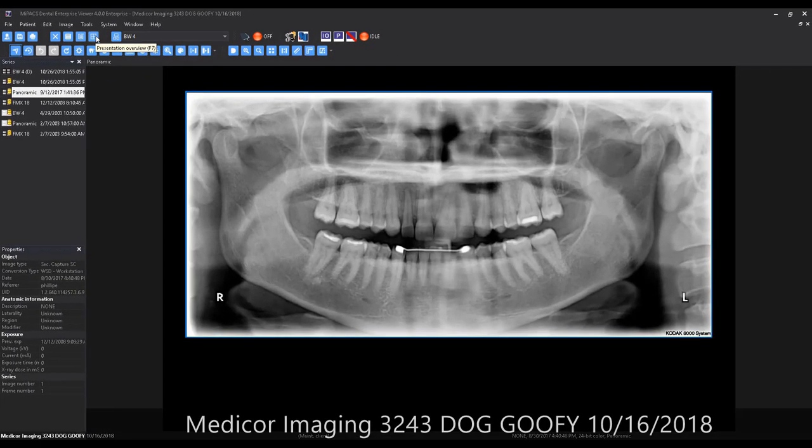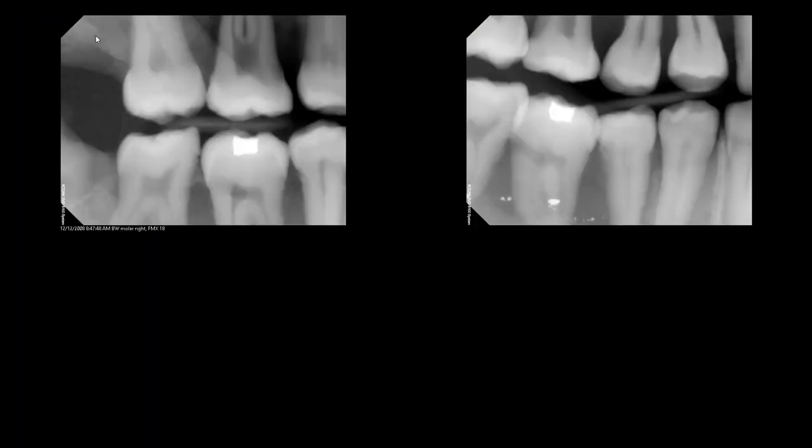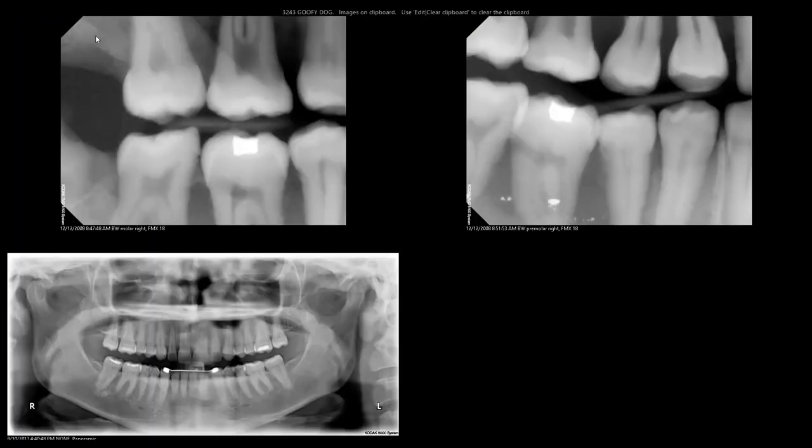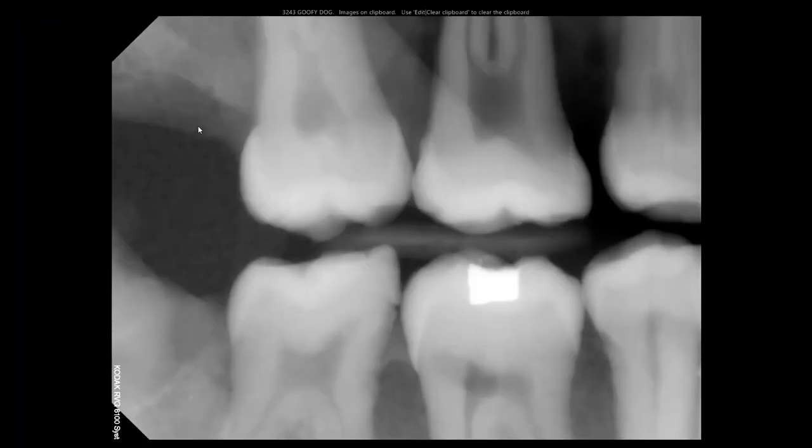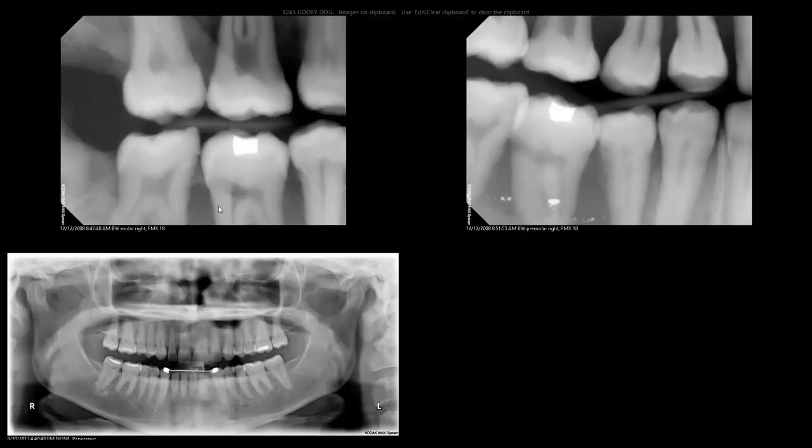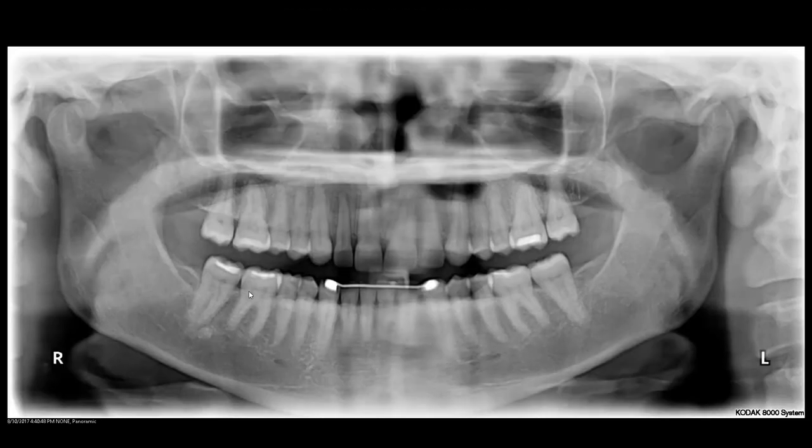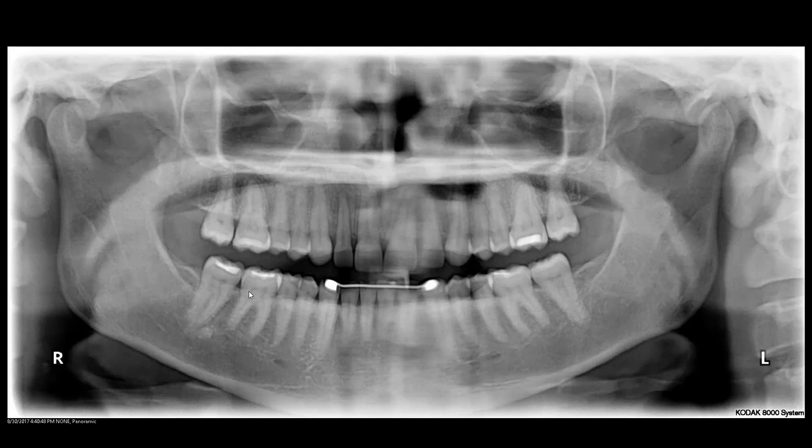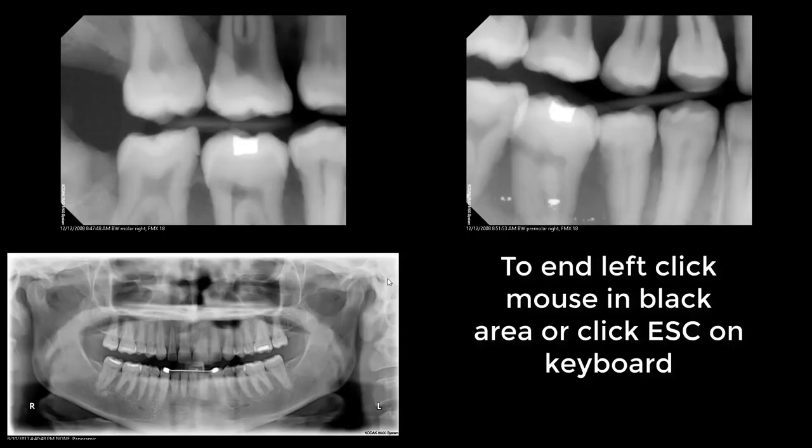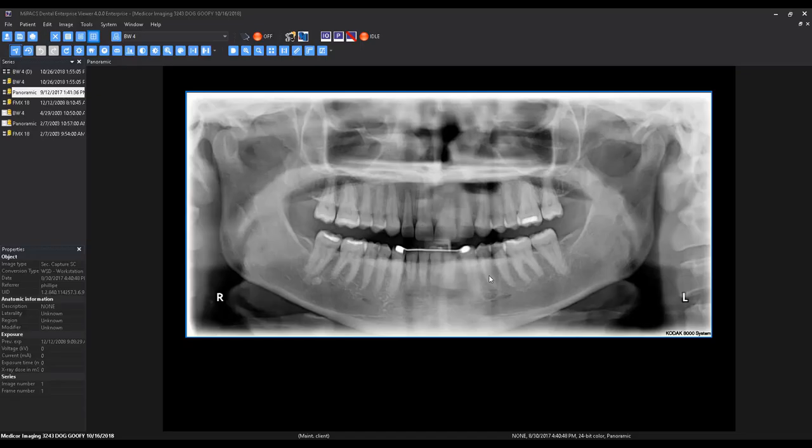If you would like to see a single image from the display, simply left-click the image to expand it. To exit the Presentation Overview, you can hit Escape on your keyboard or click anywhere in the black area on the screen.